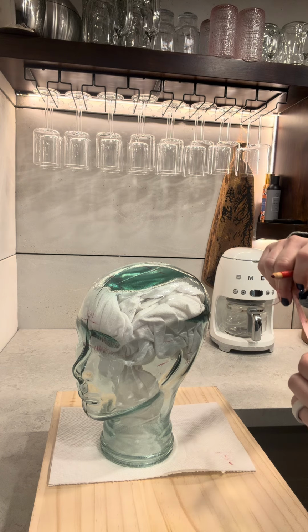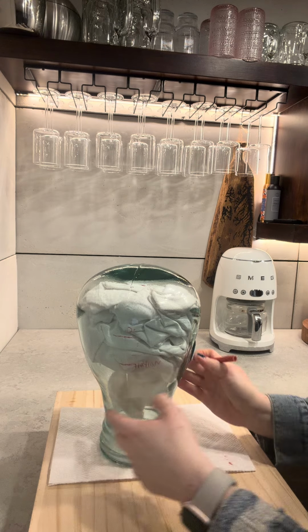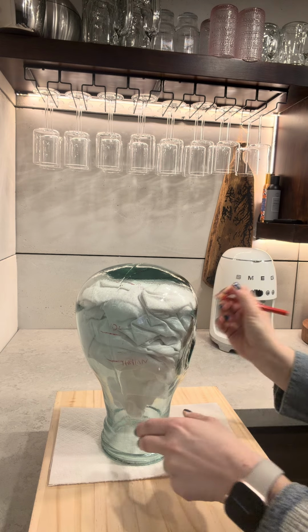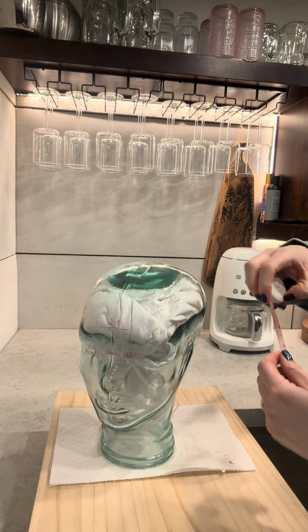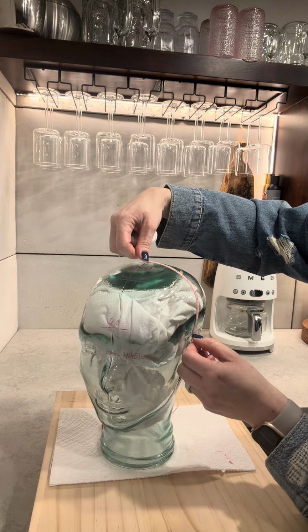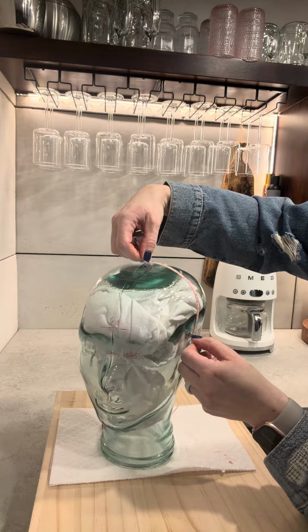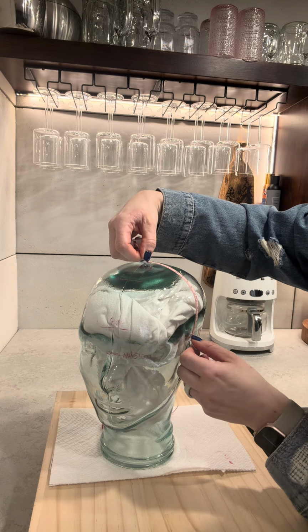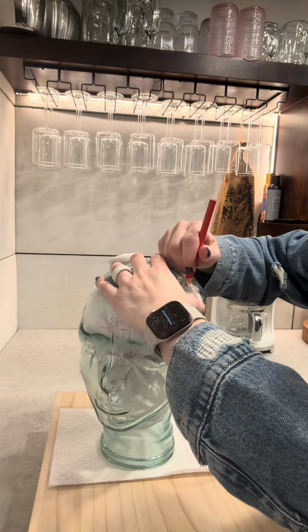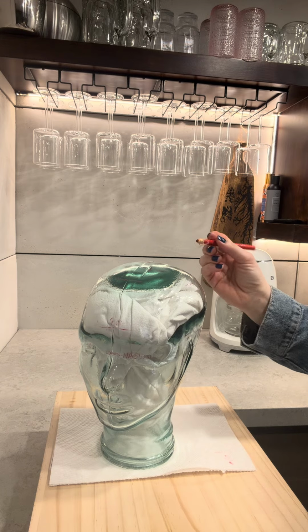Okay, and now this is my T3 and T4. Now from T3 to Cz, I'm going to divide it into 7.5, and that is my C3.